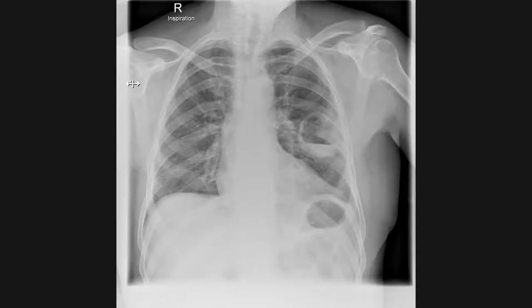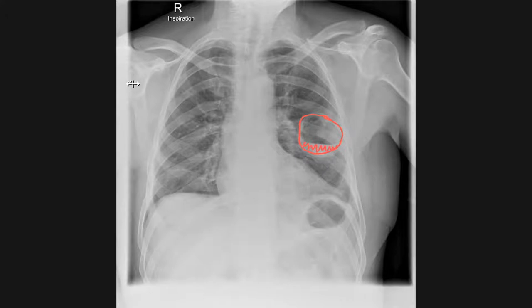This chest x-ray is from a patient who presented with a few days of shortness of breath, chest pain, and hemoptysis. There is an abnormal left mid-zone lesion which has a definite air-fluid level, in keeping with a solitary cavitating lesion.